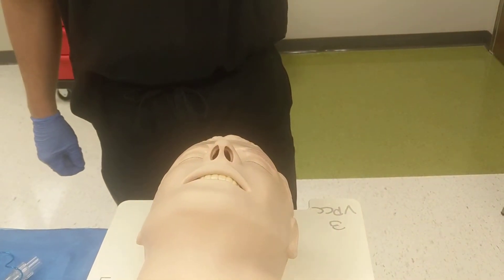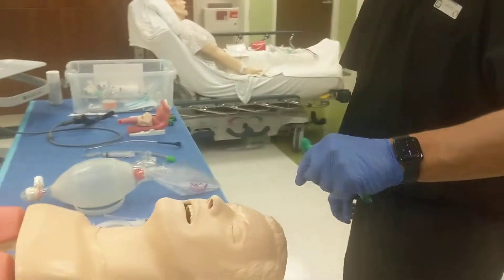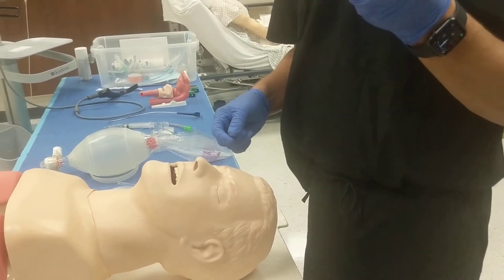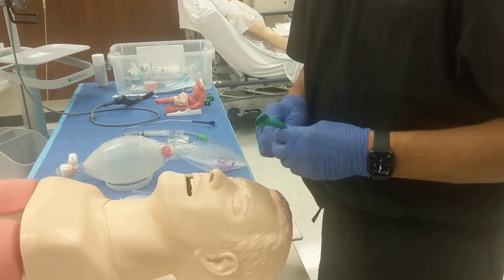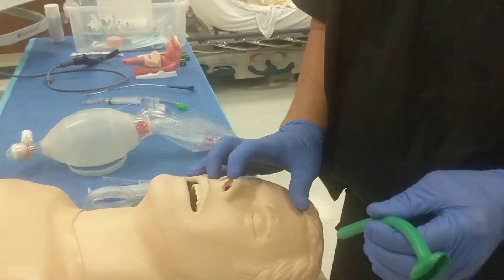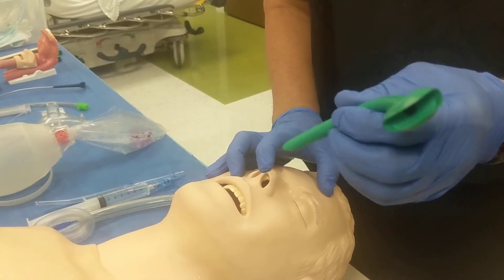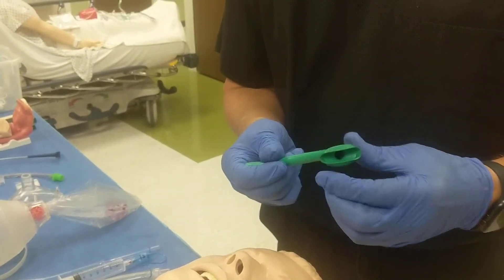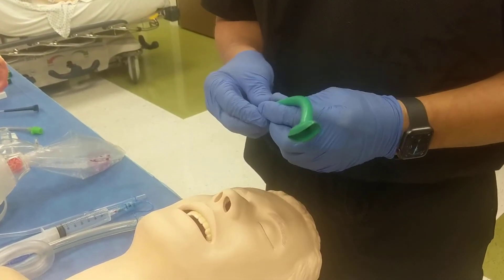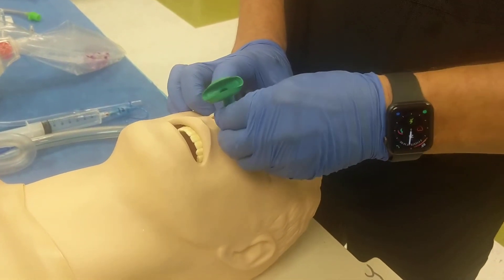The nasopharynx is directed straight posteriorly. We tend to think because of the shape of the nose that the nasopharynx curves upward, but it's actually a horizontal passageway that goes straight back. So it's critical that the airway be inserted directly posteriorly. I augment my ability to do that by pulling up slightly on the tip of the nose — you can see how that opens up the nares and forms virtually a tunnel straight back. I always hold the tube about halfway back. If you hold it too far back you lose control; if you hold it too close, you take too long to advance.